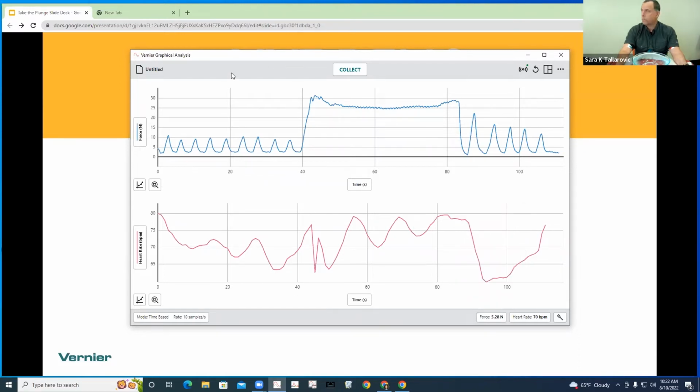All right, Angie, do we have any questions that we need to address before we move on to the next treatment? There was one that came in that I just wanted to verify the answer with you. Mary Beth has the original LabQuest with the blue bumpers, and it sounds like the EKG BTA version. If she interfaced with the GA Pro on her computer, would that combo work the same as the GoDirect sensors that you're using? So the original EKG, does it have a heart rate channel?